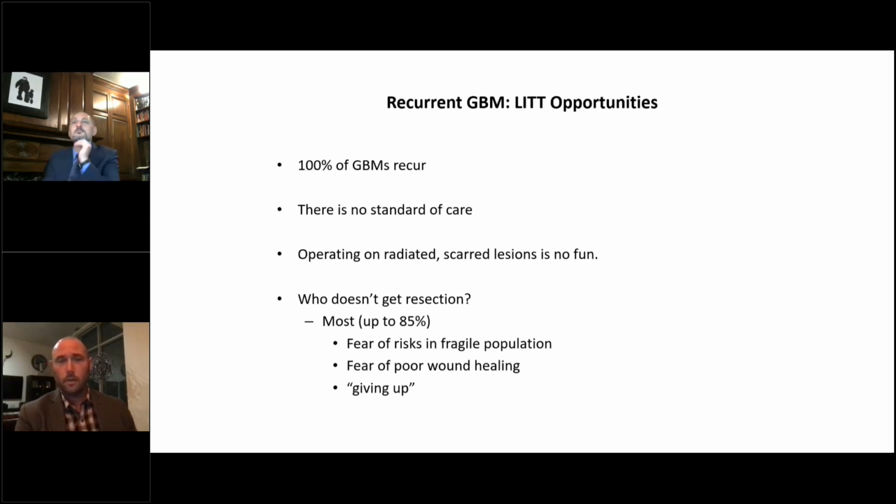and kind of re-broaden your therapeutic window, this is potentially a real excellent use of the laser. It's certainly an area where at Duke we use the laser quite frequently, in folks that may not have other clinical trial options and have a recurrent GBM and might benefit from some increased cytoreduction and have a small enough, focal enough lesion where this is beneficial to them.